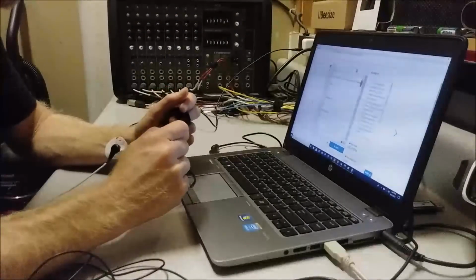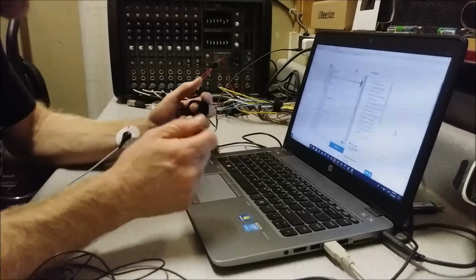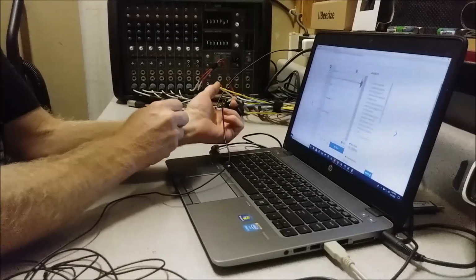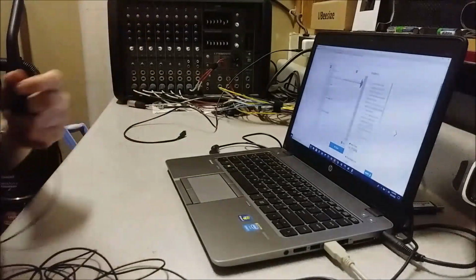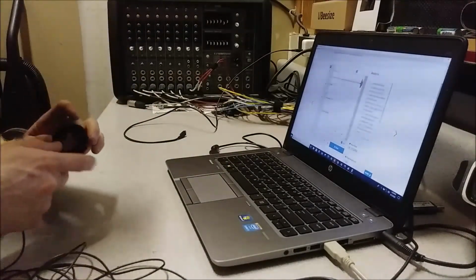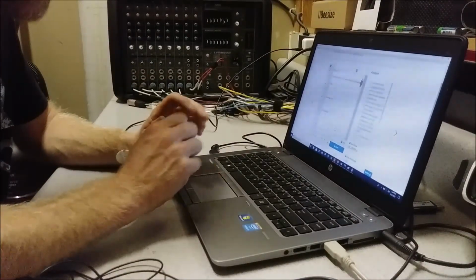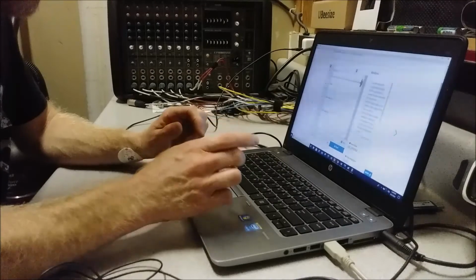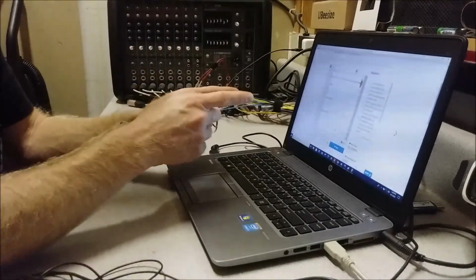Now we're going to take a look at the effects of exercise on the heart rate as well as the interval durations. So you can see I'm taking off the leads for the electrodes as well as the pulse meter. I'm going to go outside and exercise for about 3 minutes straight and then come back in and hook everything up and start taking the readings.